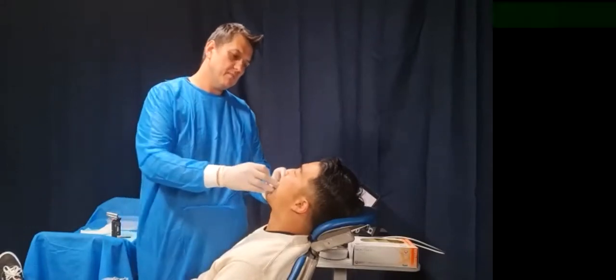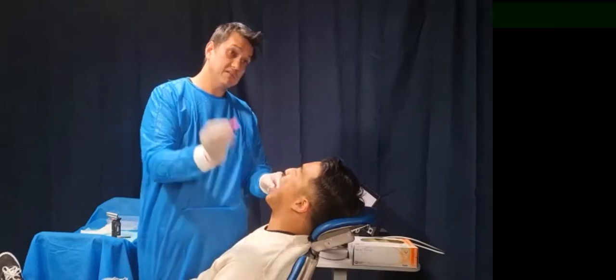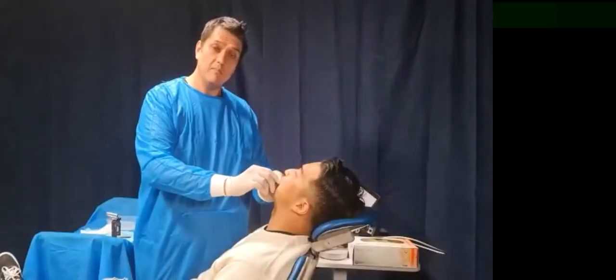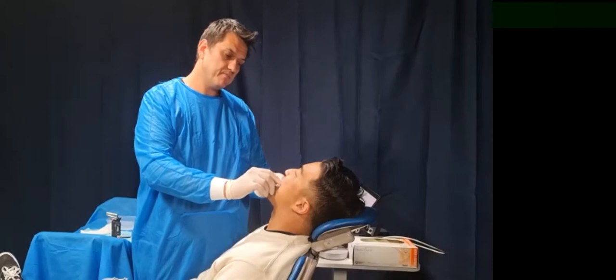So opening up for me, again, just placing, and we will get the camera to have a quick look at this. Cameraman, if you can come in now, that'd be great. I'm just placing one sausage on the left-hand side, one onto the right-hand side. Now I'm asking my patient to very slowly close, please. Keep coming, stop. Now I'm stopping him at a position, thank you very much, where I'm comfortable that that's about the thickness of a splint. So open up for me now.